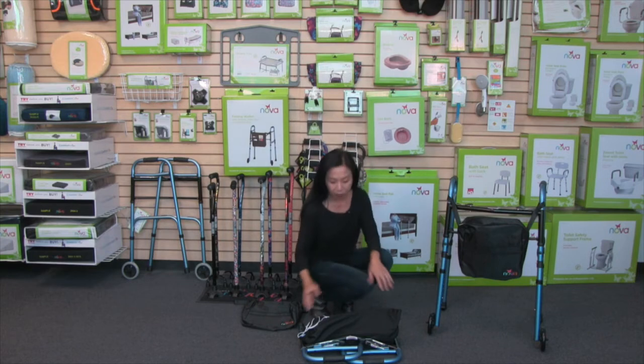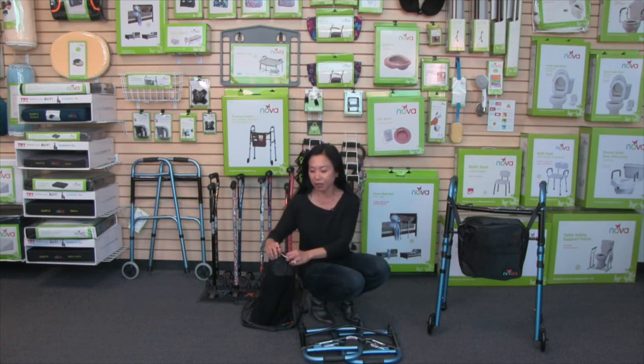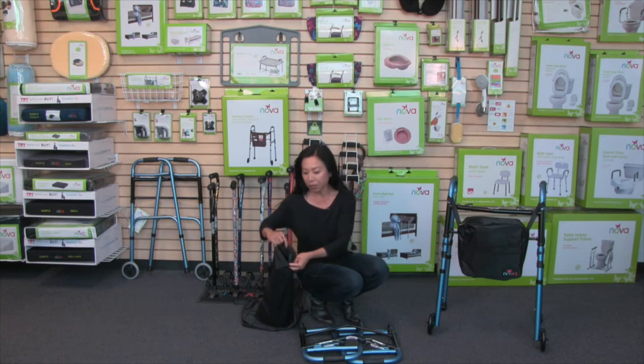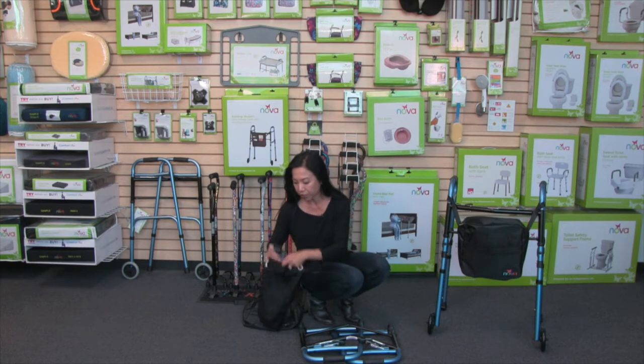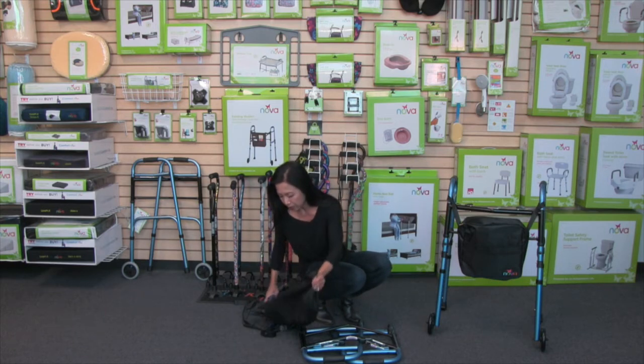When you take it out of the box, you'll notice this bag here. This is where we have the wheels and the back legs. I love this bag because it keeps these items safe and also clean from your other things. So let's take out the wheels and the back legs.